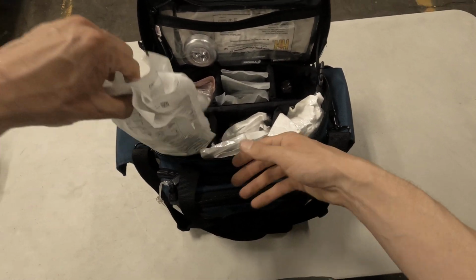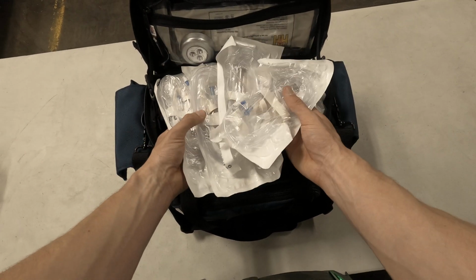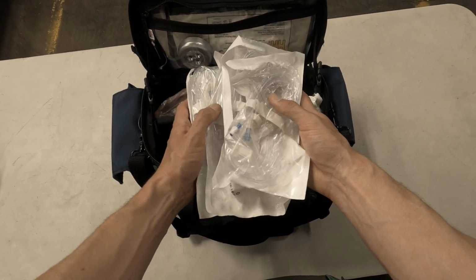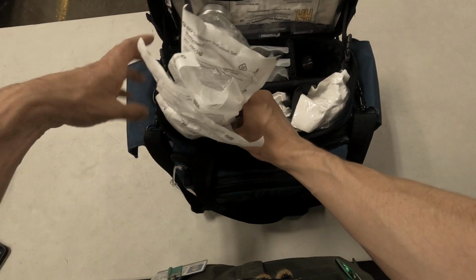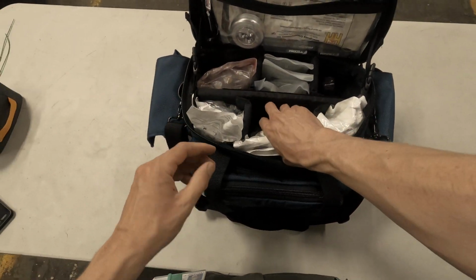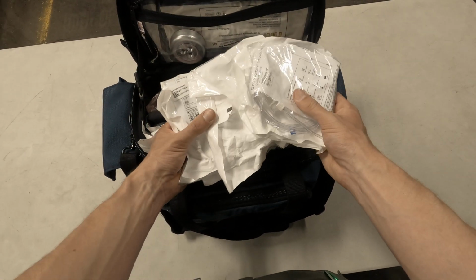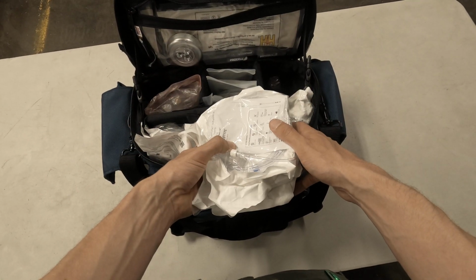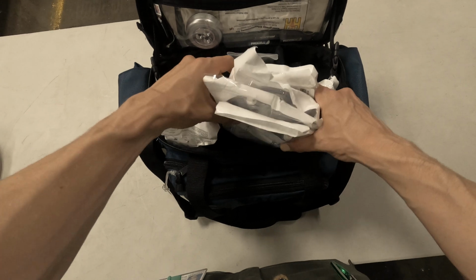Here are 4 spare full sets for the IVAC pump that we're currently using. So if you use the ones out of the black bag, you can come in here and grab your spares. Next to it is 4 spare half sets for the IVAC. If you use your half sets in your black bag and your first in bag, you can come in here and replace those.